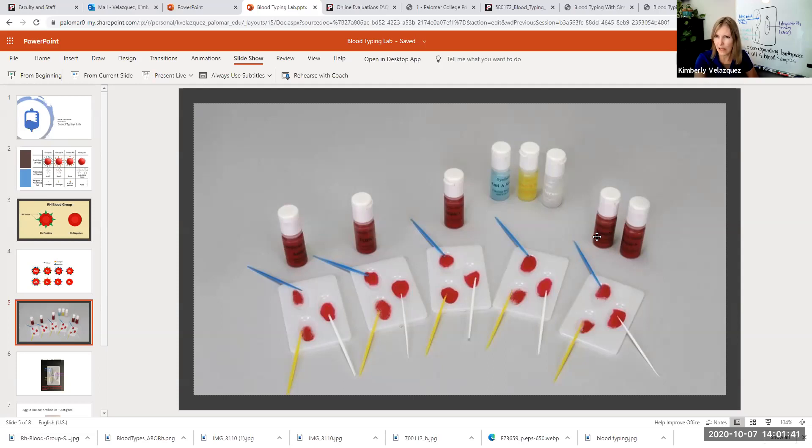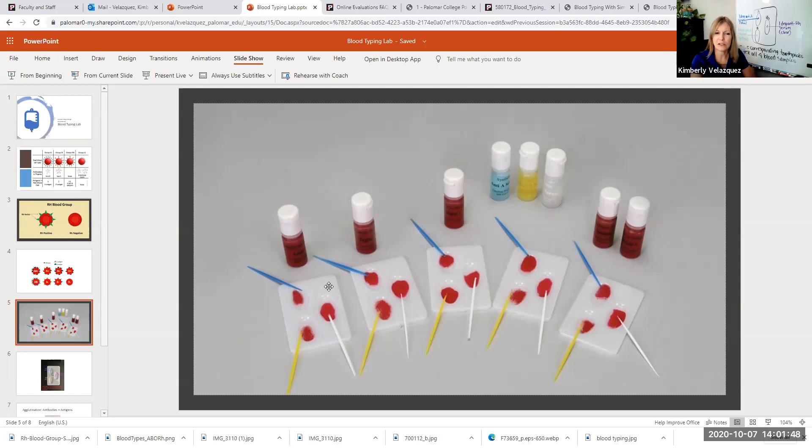What this means is after each type of blood that you test, after each of these samples is tested, you must thoroughly clean your test tray and your toothpicks each time.